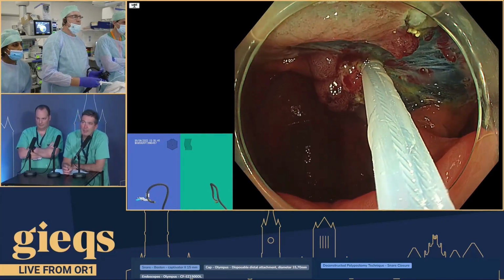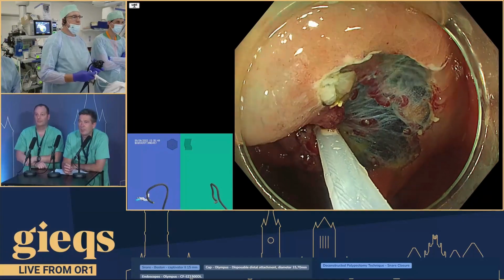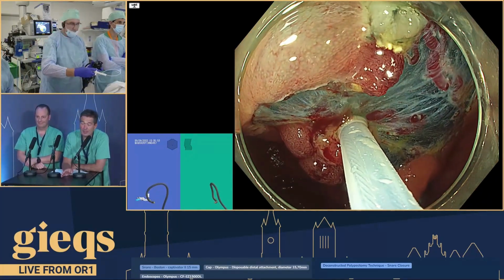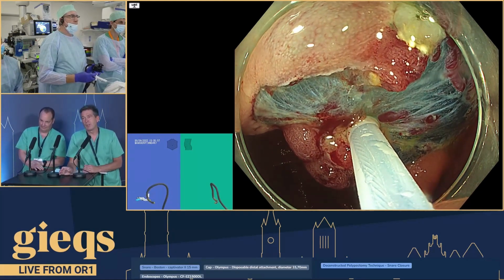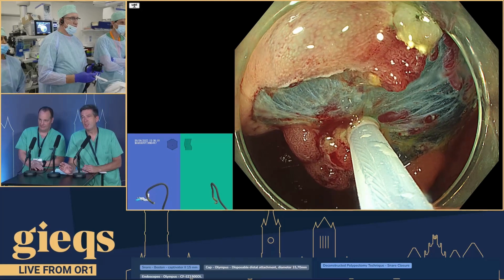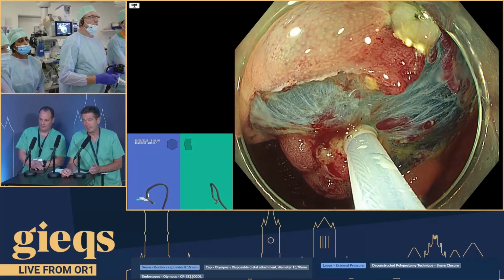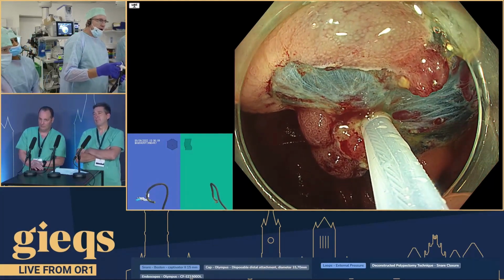So it might be helpful, Mike, to get someone, when you're going for it with a snare, to put some epigastric pressure down, just to stop the transverse coming forward. Just when you're putting pressure on the scope, it may just stop you pushing back into the ascending colon. It may not, but it might. Yeah, we could do that, but I can do it without doing that.